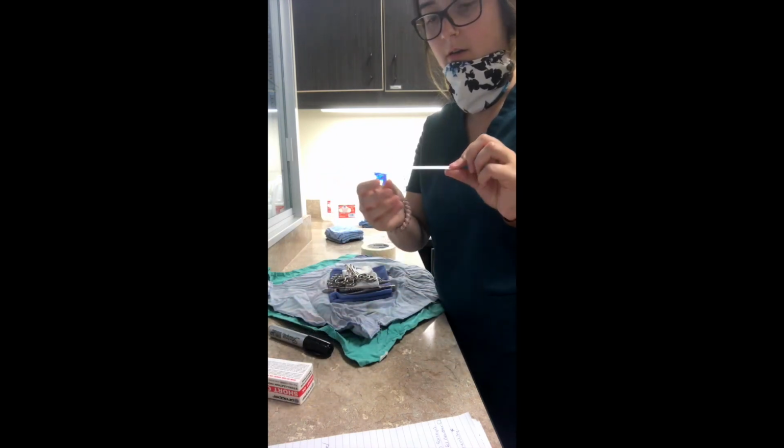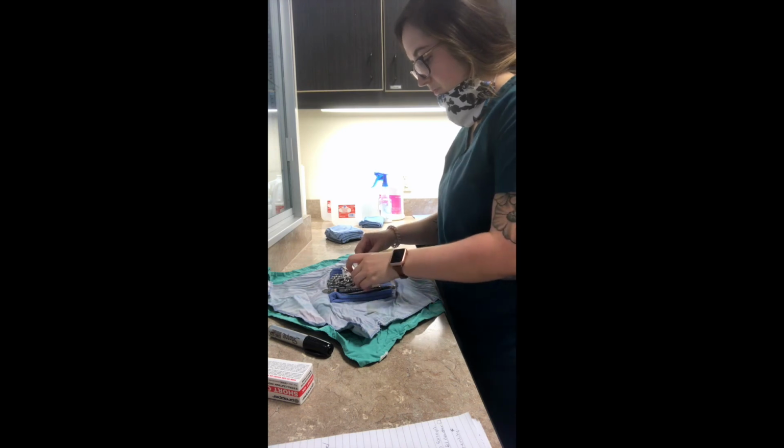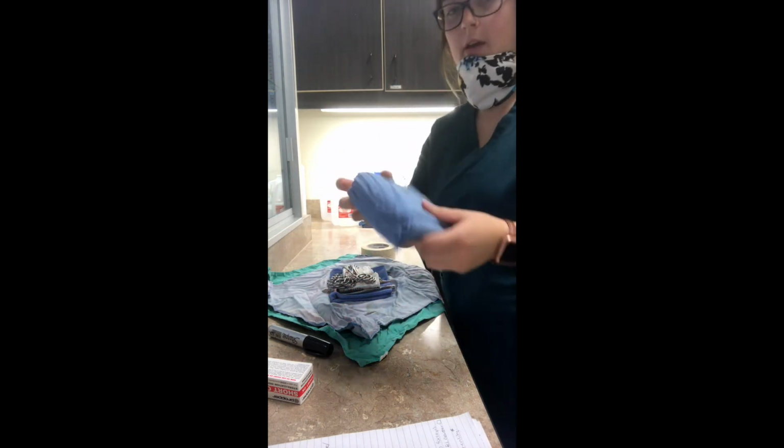Then we're going to add our indicator strip. And then we have our drape.